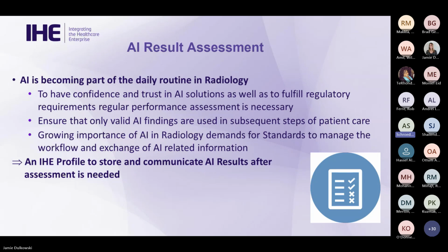AI is becoming an essential part of the radiology routine workflows, and users need to have confidence that the AI solutions behave as they want. There are also regulatory requirements, as for example in the EU AI Act, where there is a necessity to do performance assessments for the algorithms. That regulatory aspect is one important point.